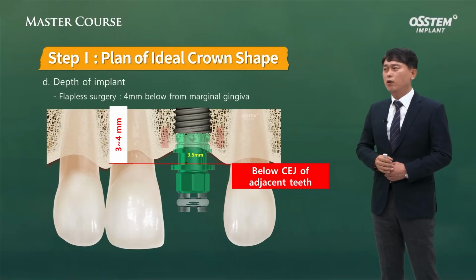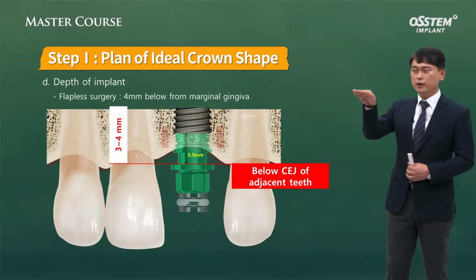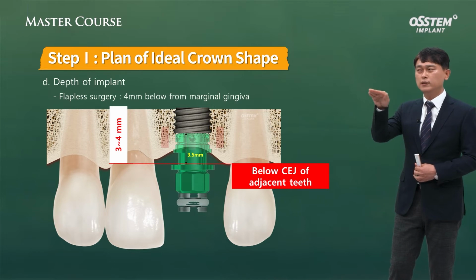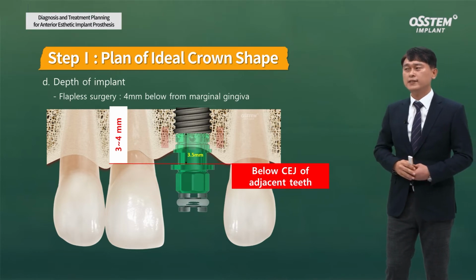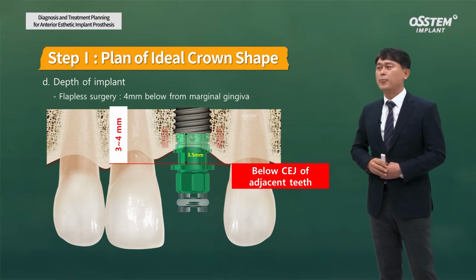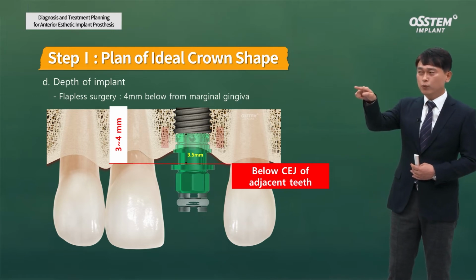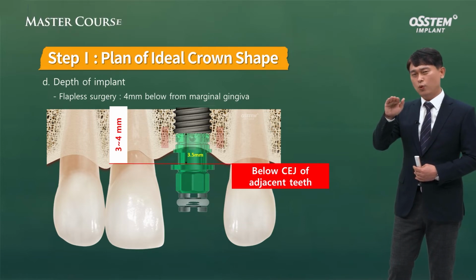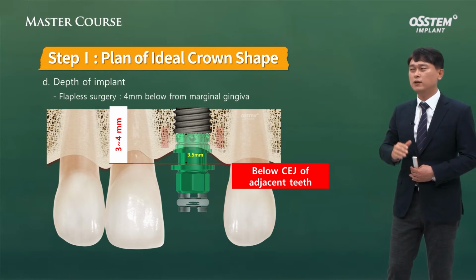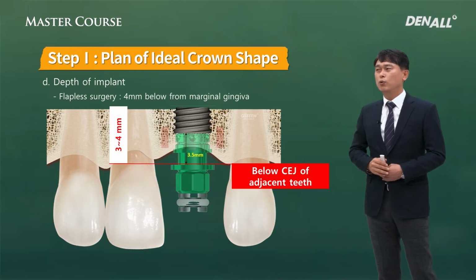In the pre-mount, below the hex structure, this structure is about 3.5 millimeter from the implant. If you look at this red line, if the implant goes in like this, it is perfect. Using this notch-like structure would help you get the right placement depth. You need to be aware of these points as you do implant placement.